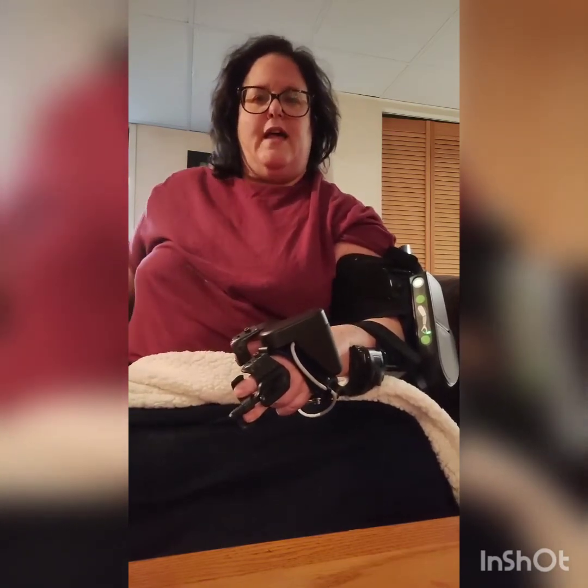So now I want to work on opening it. I just set it and it opened. So relax. And open. Hold it. And then relax. And open. And relax.